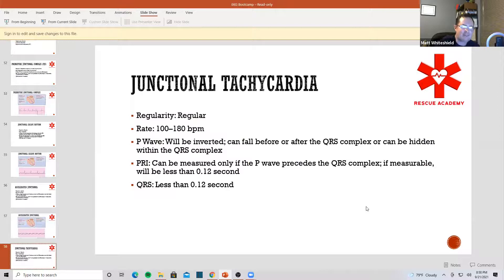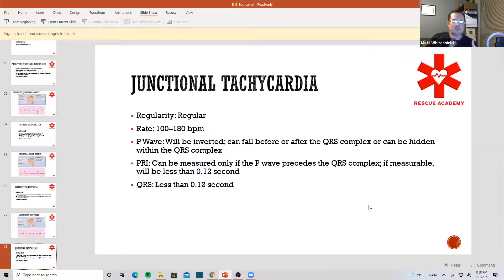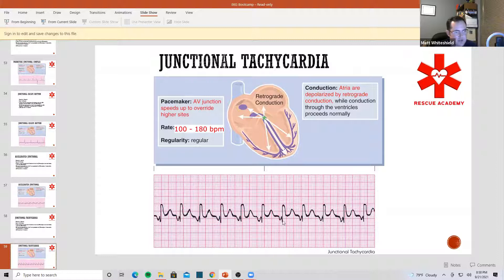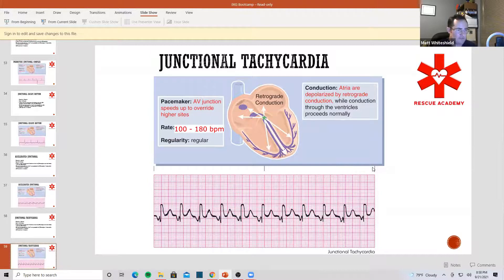Junctional tach is greater than 100. Understand that accelerated junctional and junctional tach are two completely different rhythms. Junctional tach — anything greater than 100 beats per minute. The same rules apply: narrow QRS complex with no P-wave or the P-waves are just flipped. Look at these P-waves — they're inverted.